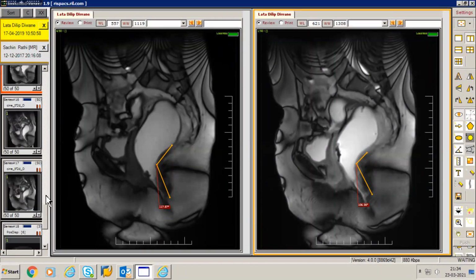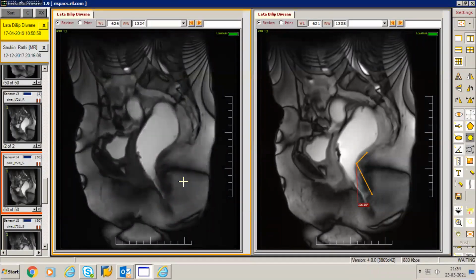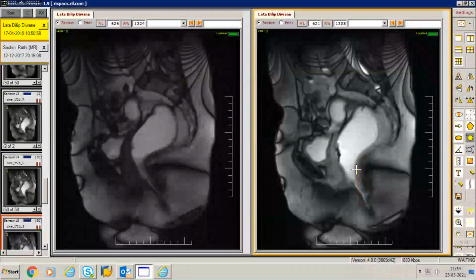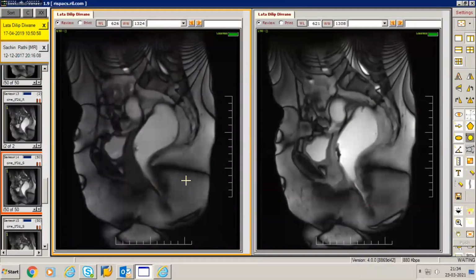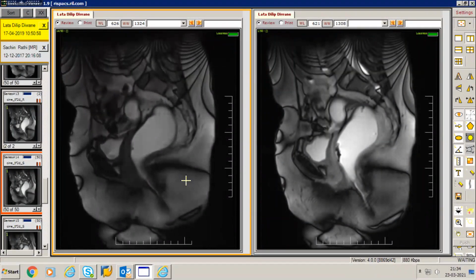The next phase of the study would be the squeeze phase. Swaroop, run the squeeze phase dynamically and show them that not only does the puborectalis contract, so naturally it pulls it up, but if you look carefully, it actually pulls the rectum higher up also, not only anteriorly, but the rectum gets pulled upwards slightly. So there's an elevation. So there are two things to note. When you're looking at puborectalis muscle indentation, is it associated with the rectal rise as well? The absence of a rectal rise and a persistent indentation usually means a dysfunction.